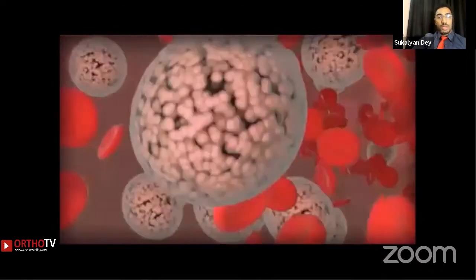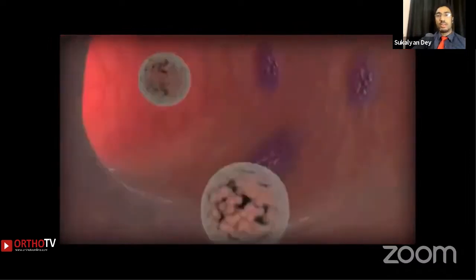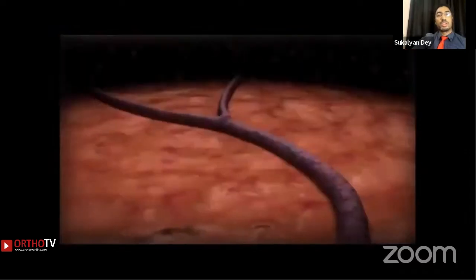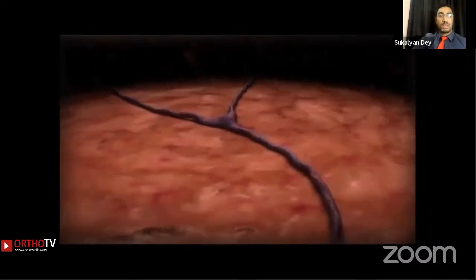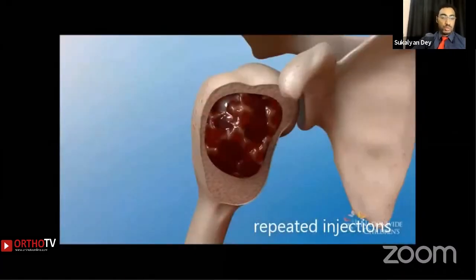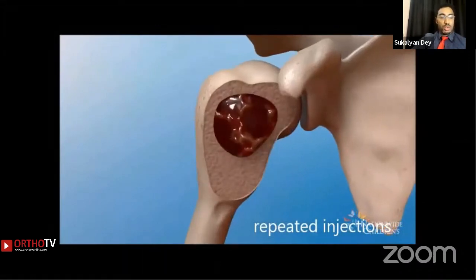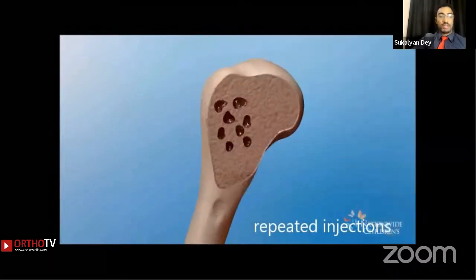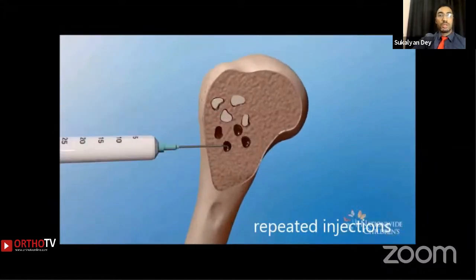Now, each time injections are given, the same phenomenon happens. The radiographic improvement is assessed at the end of 3 months, and repeat injections are given if required. Generally, on an average, 2 to 3 injections suffice, but up to 5 or 6 injections can be given without any known adverse effects. As the cysts get smaller, it is important to be able to reach all the loculi in order to make it disappear completely. The end result is restoration of the architecture of the bone and remodeling of the bone to a normal shape in the long run.